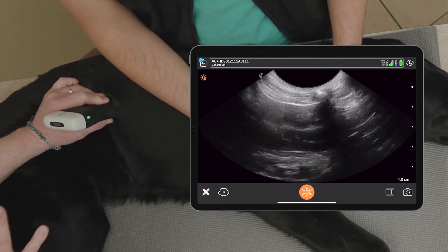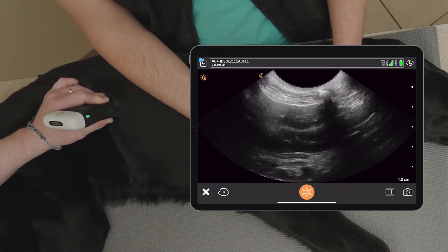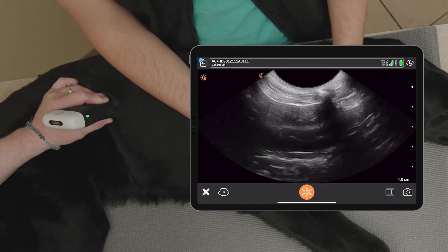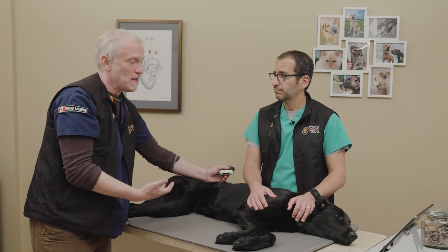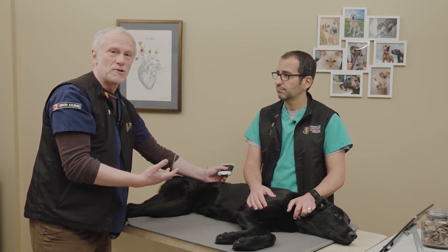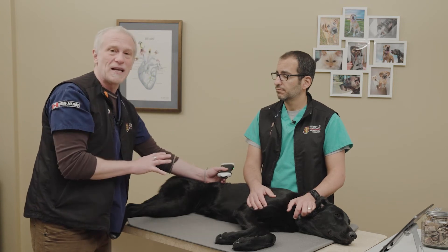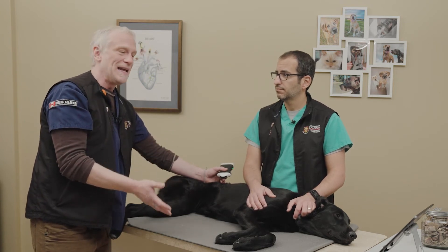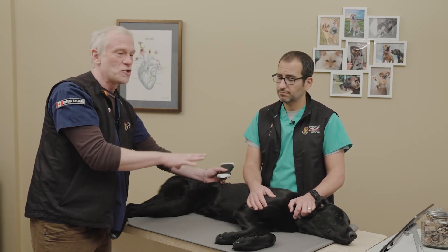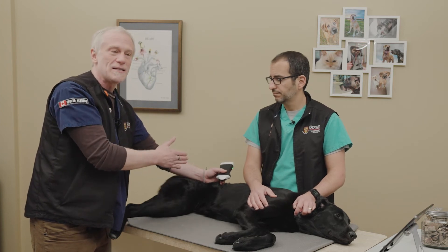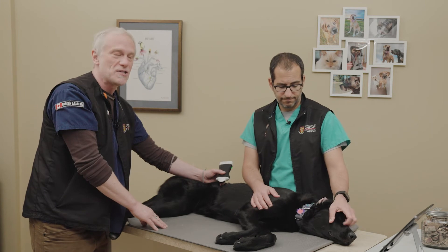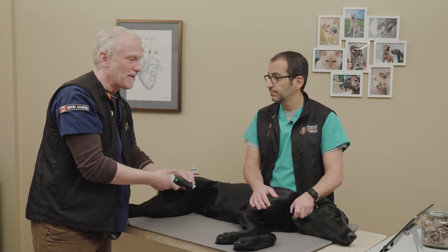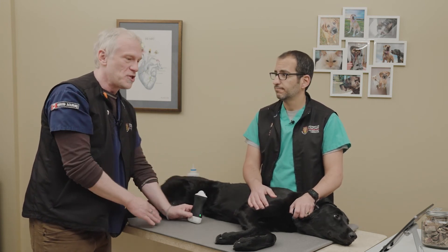Once we finish scanning in lateral, we roll the patient up into sternal or standing and do the exact same thing for the left paralumbar site. We scan patients in the position they're most comfortable. If they're in sternal or standing we look at all five sites in that position; if in lateral recumbency we scan the four sites then roll them up for the last site — scanning all five sites in all patients regardless of how they present.